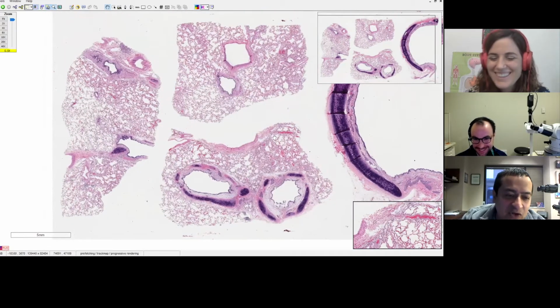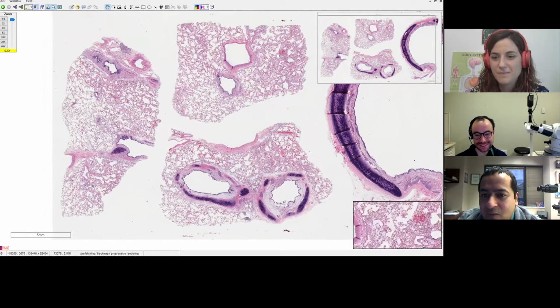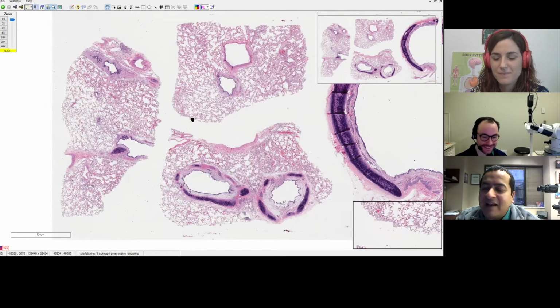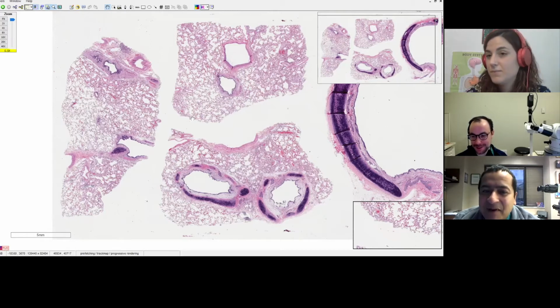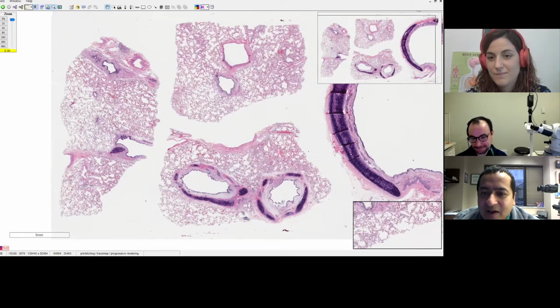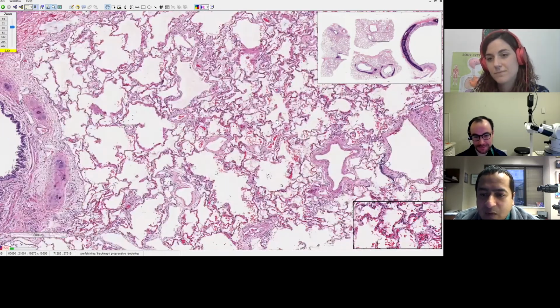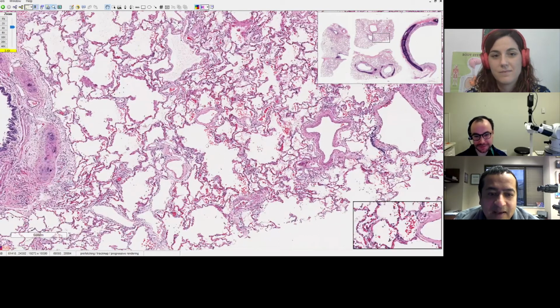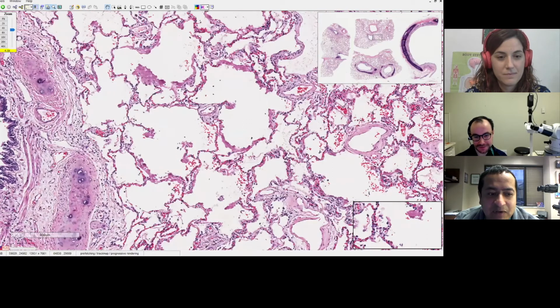Okay, so you guys, you're on the same page with me, right? There are several abnormal areas at low magnification. So one thing I'd like to point out here is that although this is going to turn out to be DAD, diffuse alveolar damage, it's not that diffuse. Yeah, I think it's a big misnomer. Some areas are normal, and some areas are very abnormal. So if you go into that one, now we are in that area of abnormality. And let's keep the bronchus here for reference, to the left.